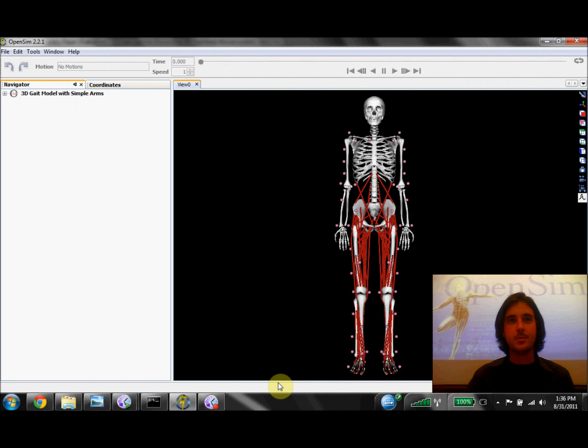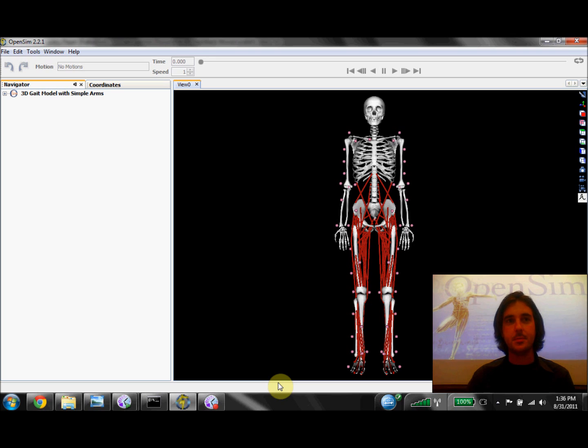Hi, I'm Sam Hamner, a PhD student at Stanford and a member of the OpenSim project. Today I'm going to show you how to get started with the scale tool in OpenSim. The scale tool allows you to change the size and mass of a model so that it matches a specific subject you've measured in the lab.